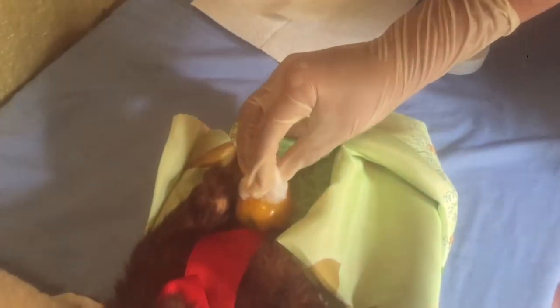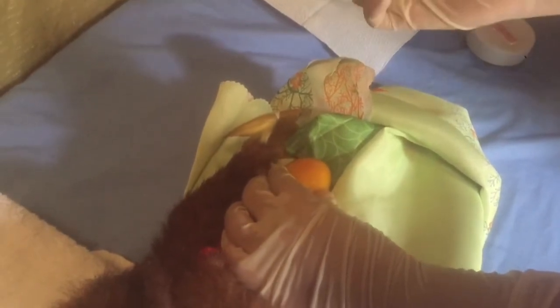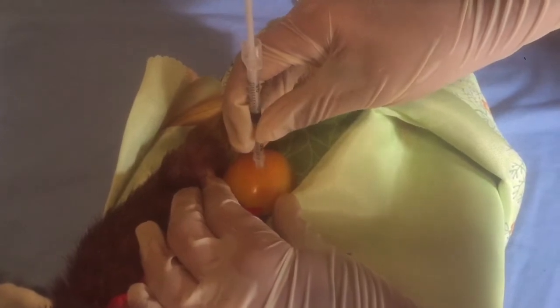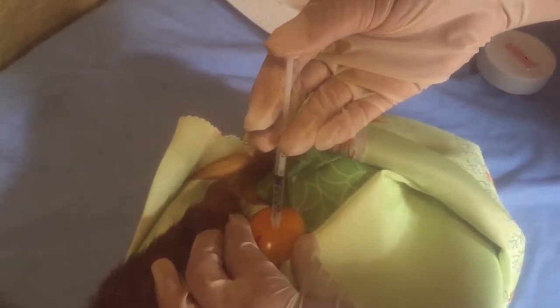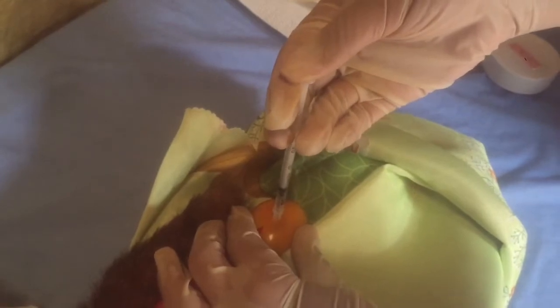With your non-dominant hand, hold the skin around the injection site. This secures the area of the injection. Quickly insert the needle into the muscle at a 90-degree angle. Make sure to insert the needle in a dart-like motion, with the bevel turned toward the skin. Use the thumb and forefinger of the dominant hand to hold the syringe.